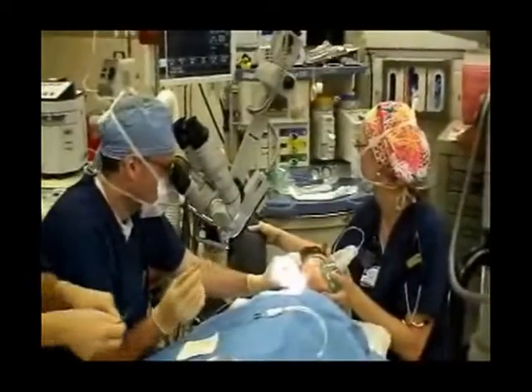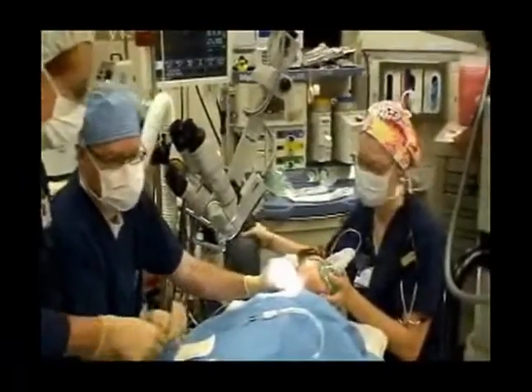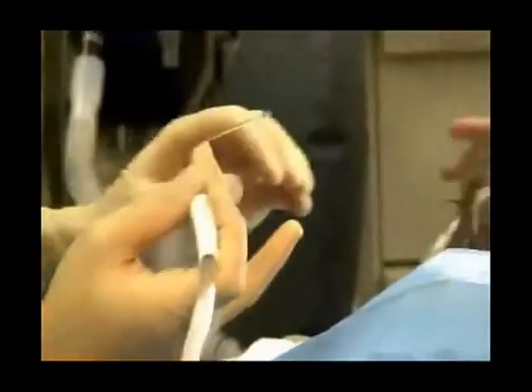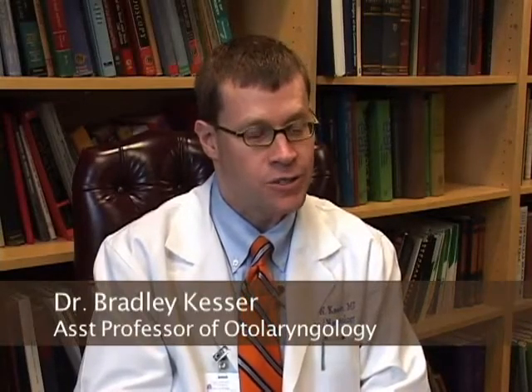A team of undergraduate engineering students at the University of Virginia has developed a tool that helps with one of the most common problems brought to pediatricians. Fluid in the middle ear of children is the #1 diagnosis that children present to pediatricians, family medicine doctors, and emergency rooms across the country. When children have ear infections, they're fussy, they don't sleep well, sometimes they have fever, and they can have an associated hearing loss because of fluid in the middle ear space.